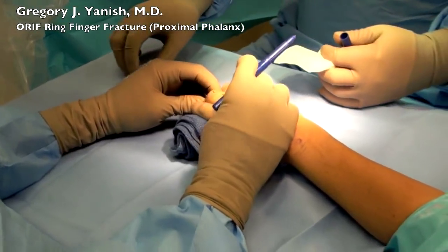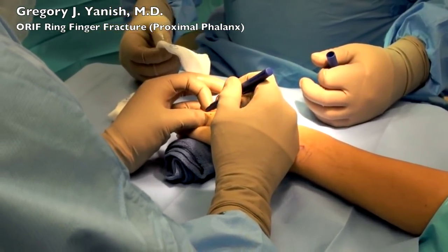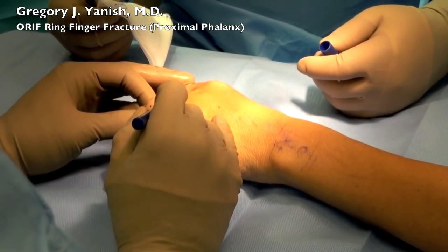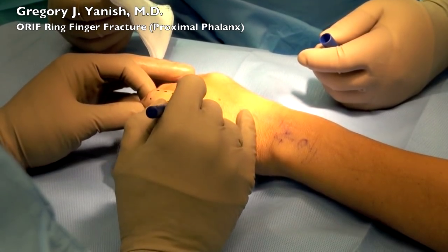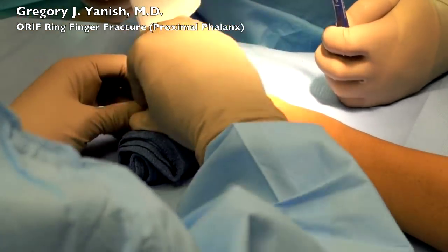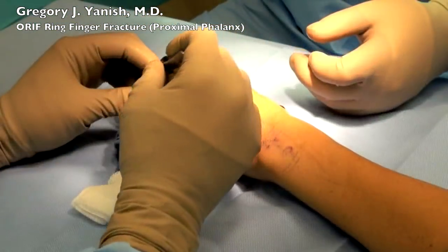I have several options here. Some surgeons go directly through the middle of the finger on the dorsal surface or the top back of the hand. I like to go along the side if I can, and that helps me stay out of the extensor tendon, which is nice for post-operative healing. In this particular patient we've marked the incision on the side of the finger.